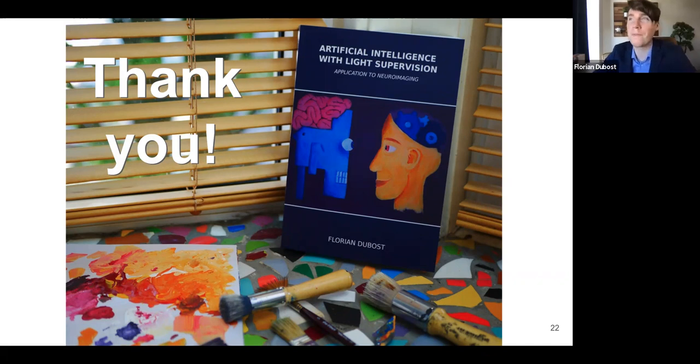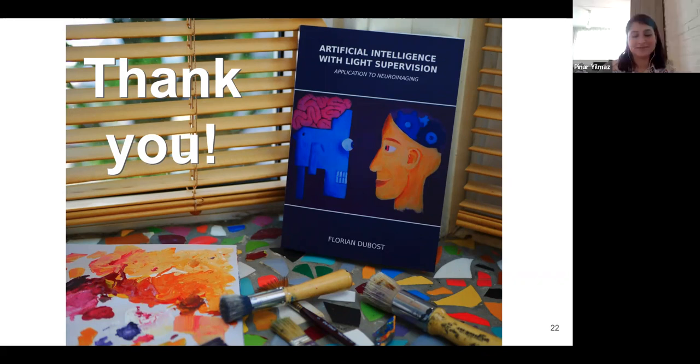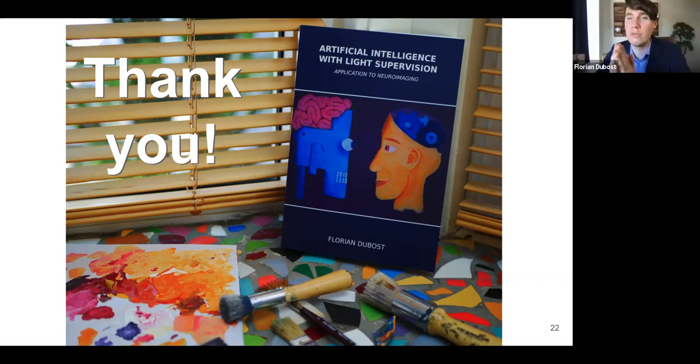So first of all, with the attention map, the point is that it's not trained. The network is not trained to specifically focus on some region of the image because you have an image-wise label. The network is just trying to reproduce this image-wise label with any information it can find in the image. So we don't force it to look at some region of the image. So I'm not sure that's really the problem.